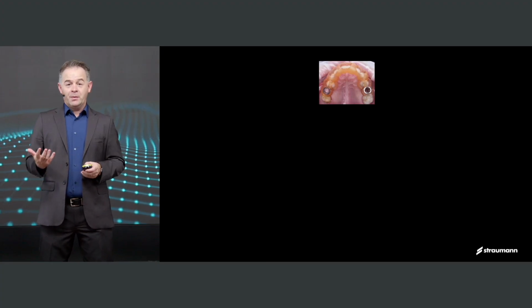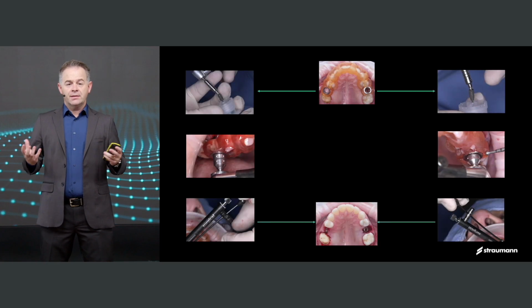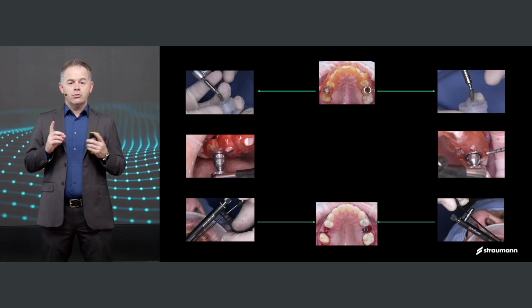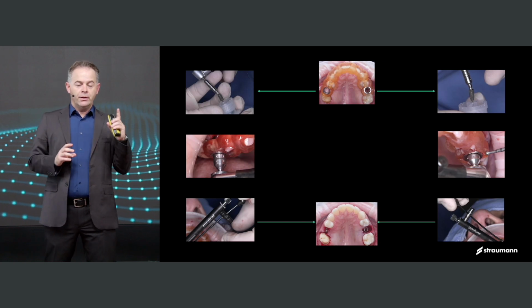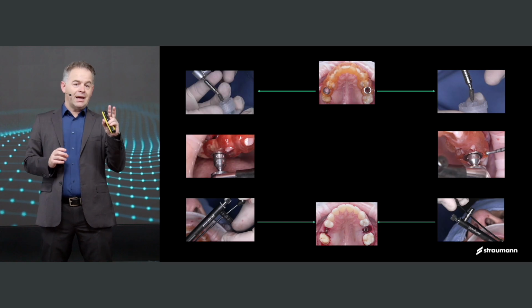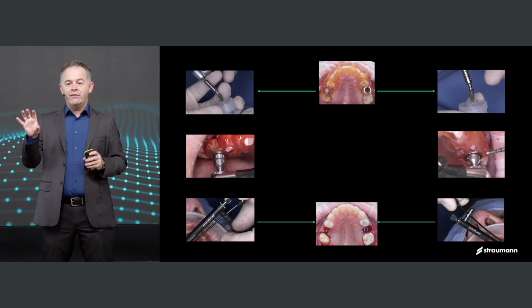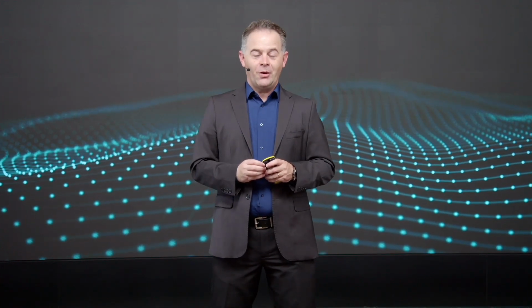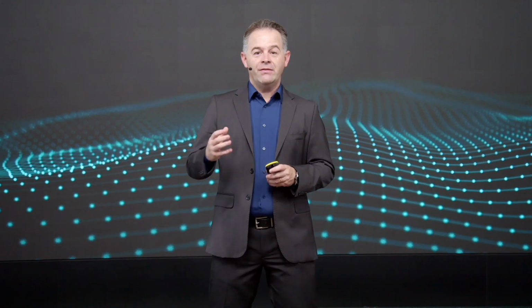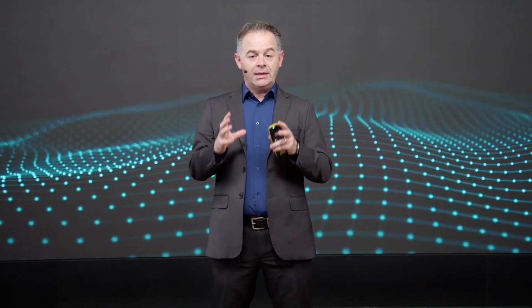And for the implant placement itself, you see bilaterally, they were all seamless. I was able to insert the driver perfectly through the guide, and both implants on site 15, 35 Newton centimeters, and on 25, almost 50 Newton centimeters. So this gives us a lot of peace of mind that we can even temporize it if we want to. So we're safe that primary stability is granted.